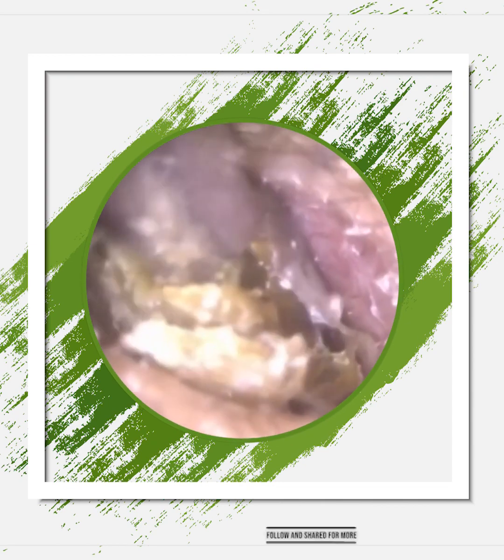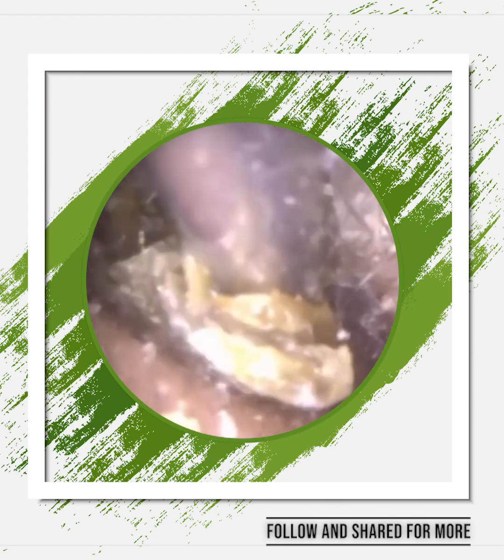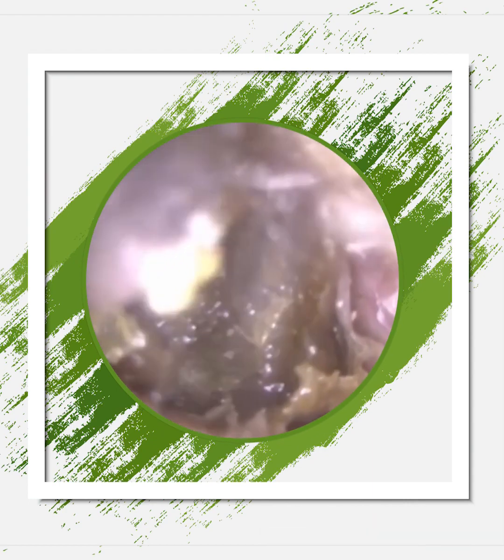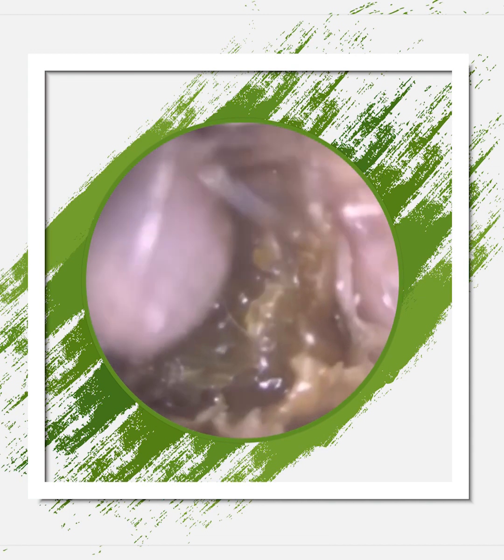The patient felt this ear was the worst out of the two, and I'm just using a Zollner suction probe to tease out this very dry, crumbly wax. You can see the patient has got otitis externa, some eczema of the lateral part of the ear canal, so it's some very dry, flaky skin. Thus far, the Zollner suction probe is very effective.